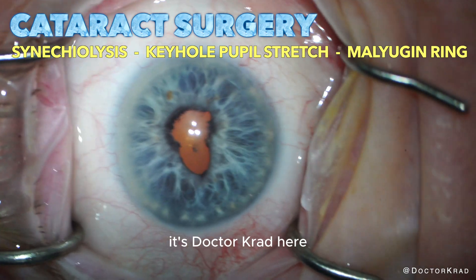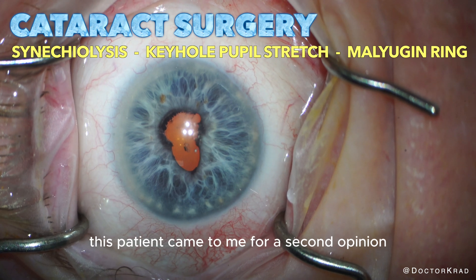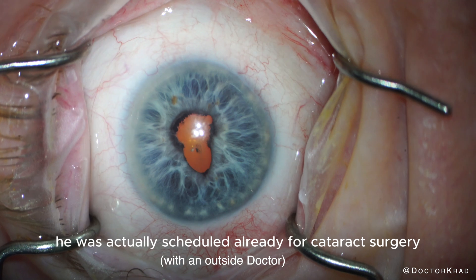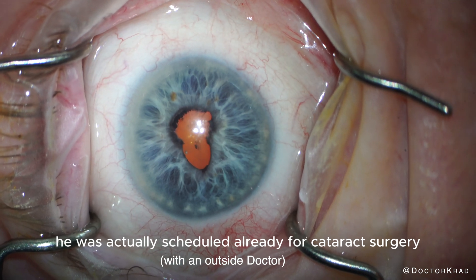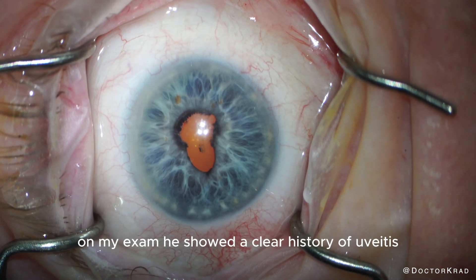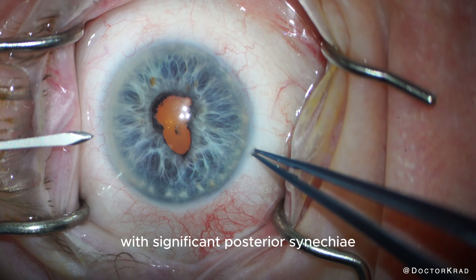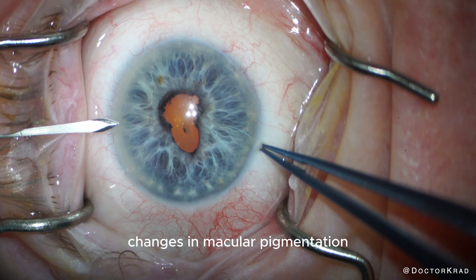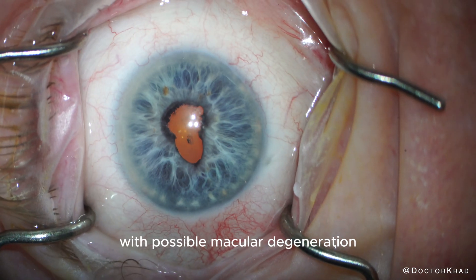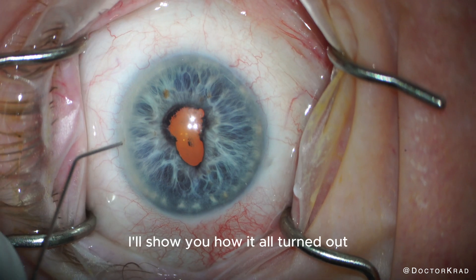Hi everyone, it's Dr. Cradd here, and today I'm going to share an interesting case with you. This patient came to me for a second opinion. The following week, he was actually scheduled already for cataract surgery with laser and with the Panoptix lens. On my exam, he showed a clear history of uveitis with significant posterior synechiae, changes in macular pigmentation, with possible macular degeneration. I'll let you know how I approach this case, and if you stick around, I'll show you how it all turned out.